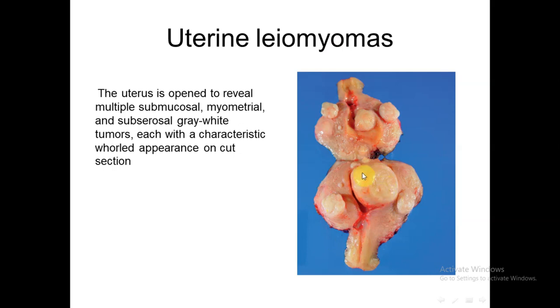They are variable in size, and their location can be either submucosal, intramural, these are intramural leiomyomas, or subserosal.